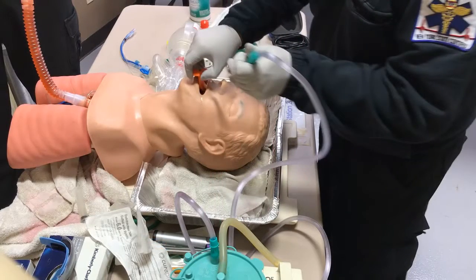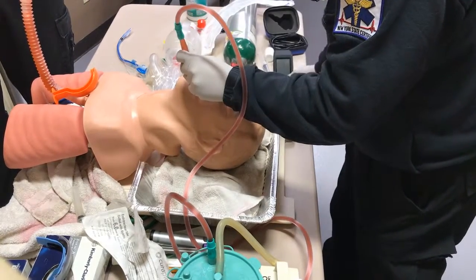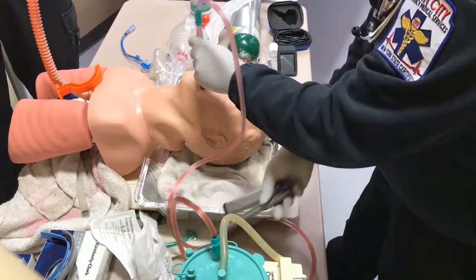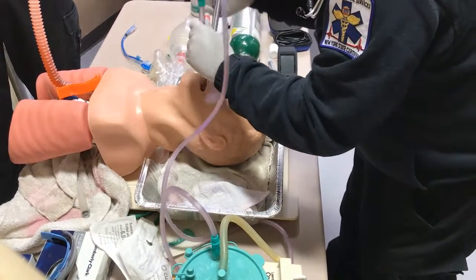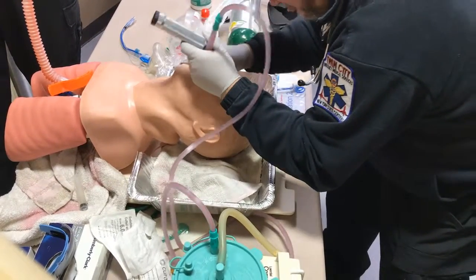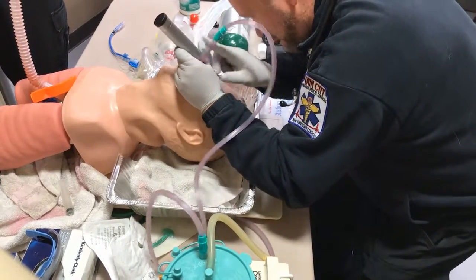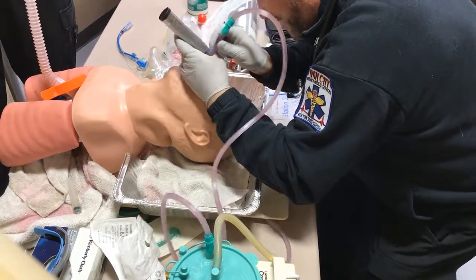What you're going to see here is paramedic Dominic Wallenzak, who's just realized that his patient's mouth is full of vomit — it's not really vomit, it's colored water that I put together on this old mannequin here. You're going to see Dominic engage in this technique. Basically, the process is this: you're going to enter the airway with the rigid suction catheter, ready your laryngoscope blade, and Dominic is going to use his left hand to hold both the catheter and the laryngoscope until he can visualize down to the bottom of the airway.